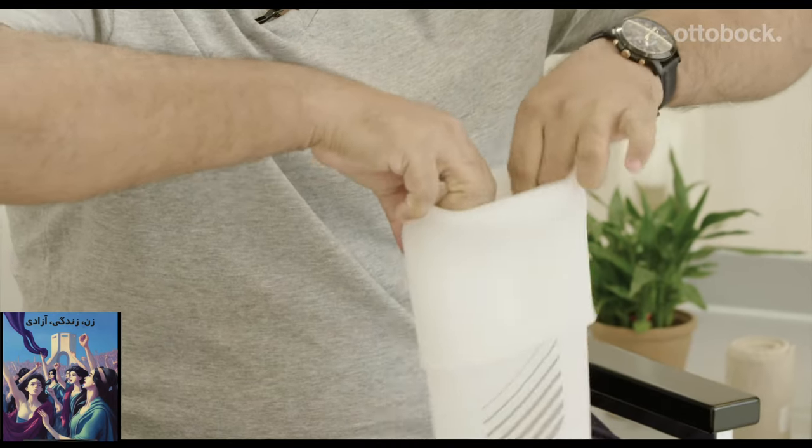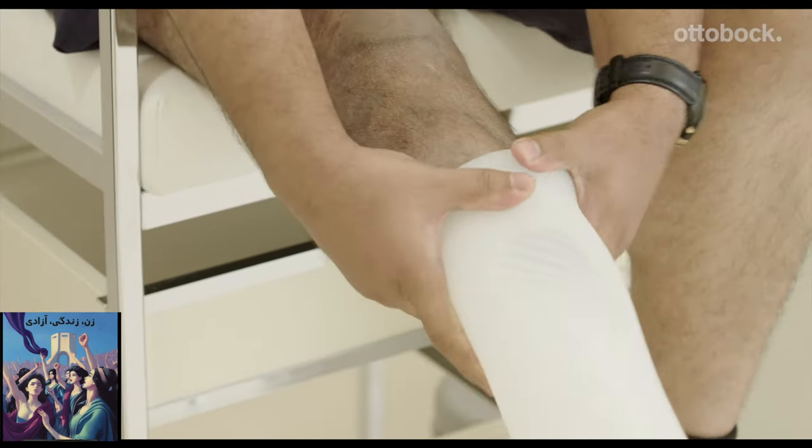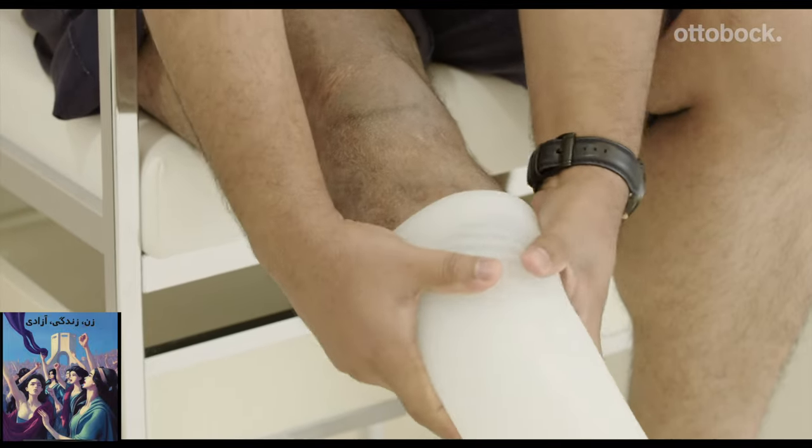While using a compression liner, make sure no air is trapped between the liner and the skin of your residual limb. You want the liner to be as close and completely in contact with the skin of your residual limb.